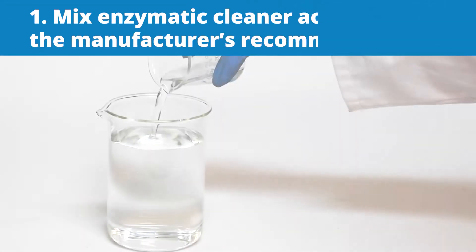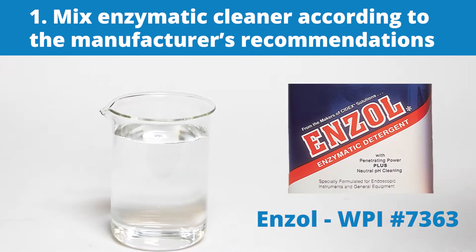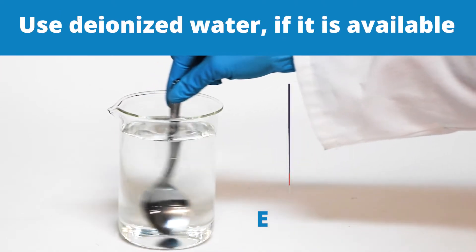First, mix an enzymatic cleaner or another neutral pH or mild alkaline detergent according to the manufacturer's recommendation. Use deionized water if it's available.